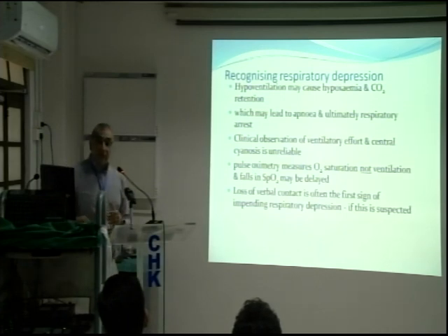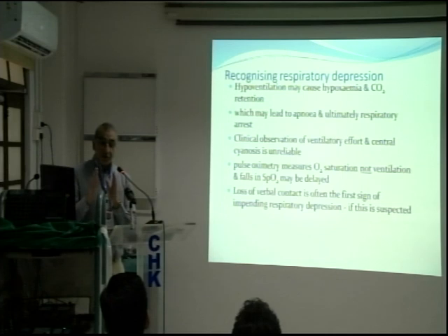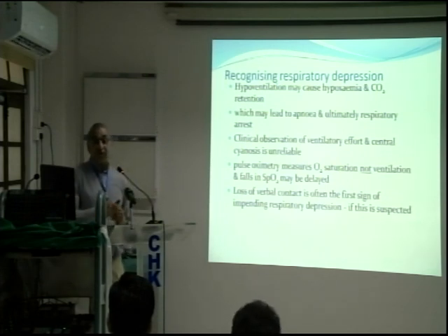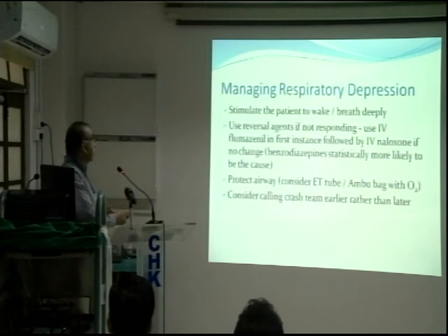Important thing is, when the alarm starts going off on your pulse oximeter, do not ignore that. Don't carry on with the procedure. Stop. The alarm is there for a purpose. It is to warn you. If you do not respond to it, then you are letting yourself into a major complication, right?